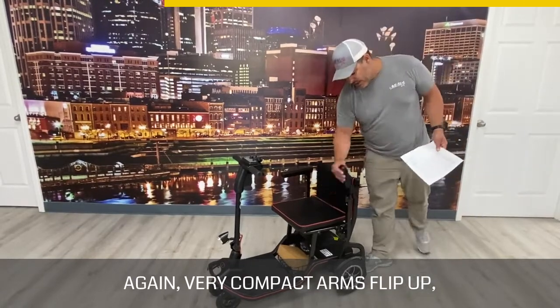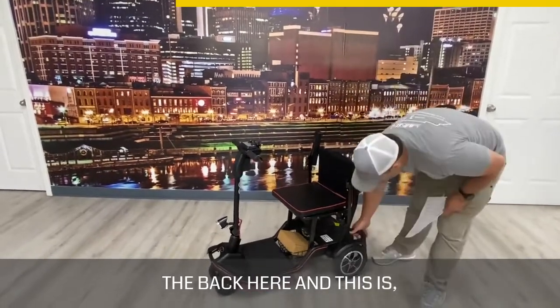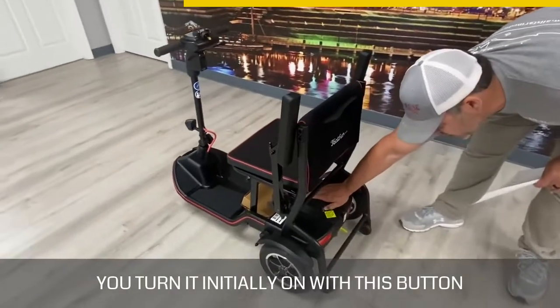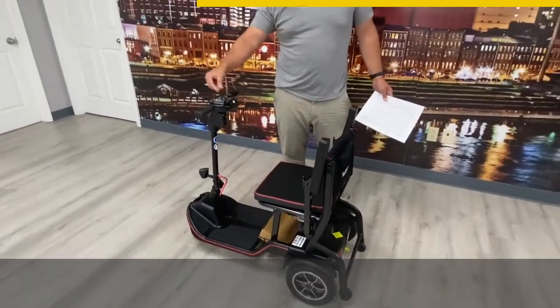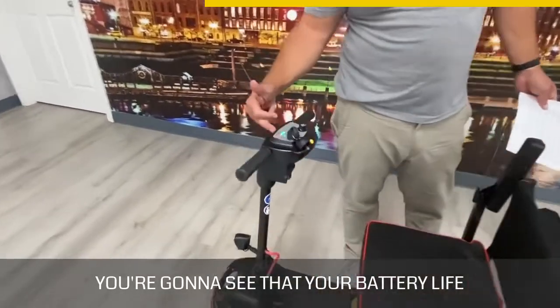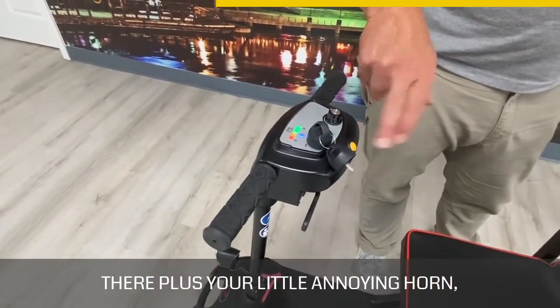Very compact — the arms flip up and pop out of the way. You have a button on the back here that you turn it on with initially, and that turns everything on. Then right here you're going to see that your battery life shows up. This is your speed dial, like most all the mobility scooters out there, plus your little horn.